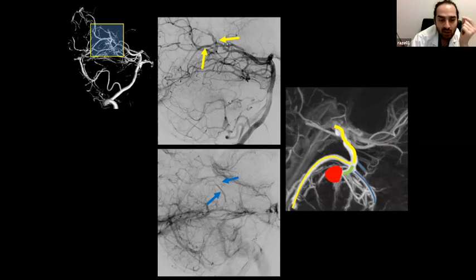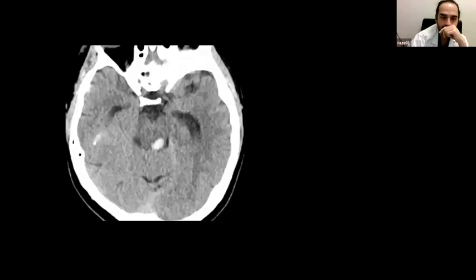They're not outflow of the fistula, but instead outflow of the normal brainstem. So by combining the analysis of the 3D and the 2D imaging, we can really understand that this is an AVM that needs to go to surgery, because only the surgeon will be able to selectively and precisely close the AVM and preserve these brainstem veins.